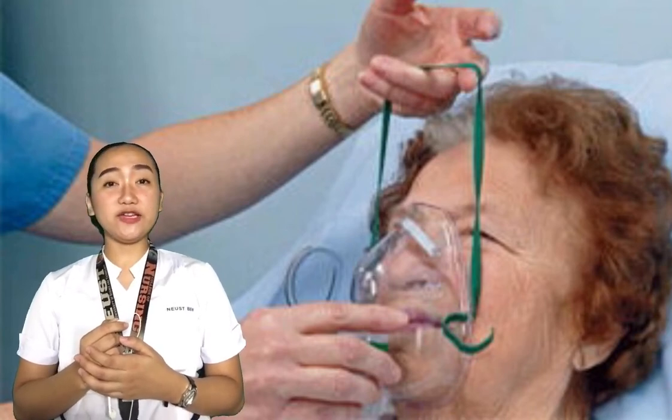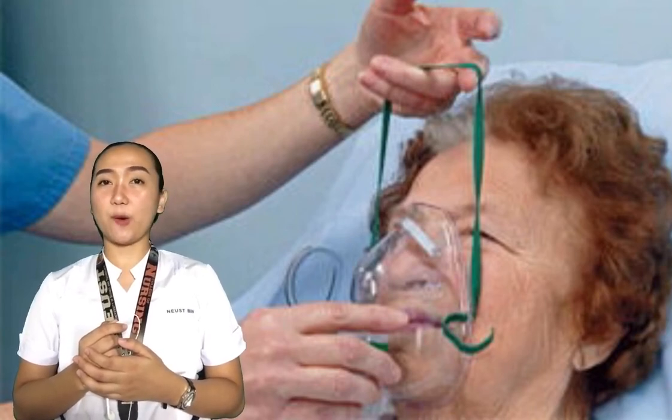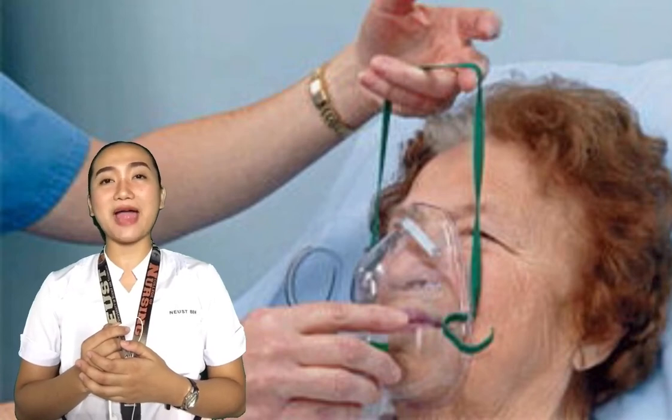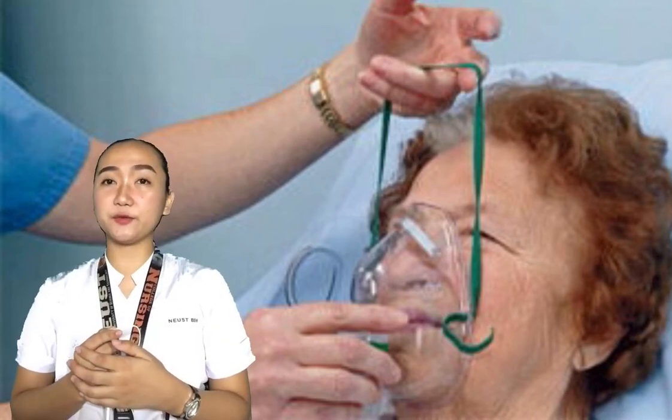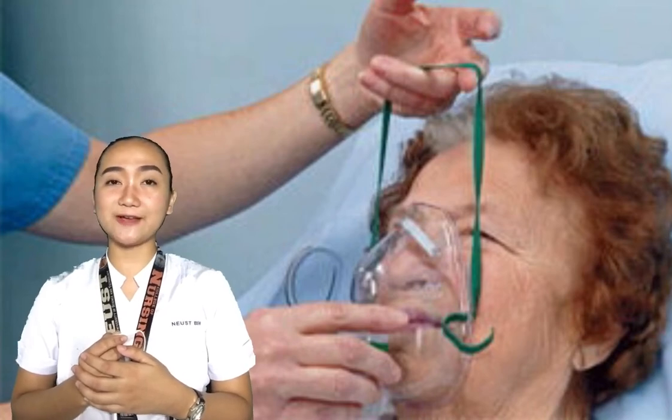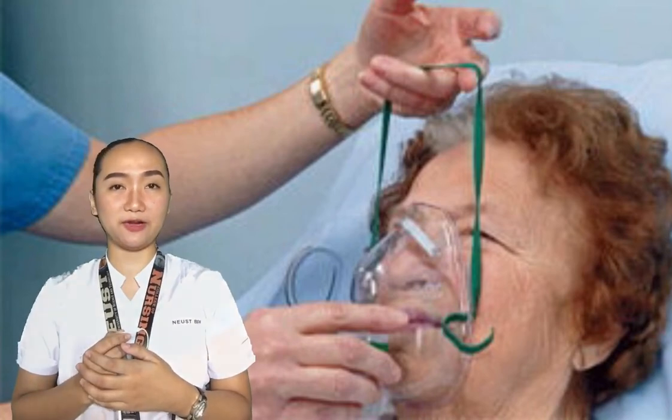Before today's video, I'm going to administer oxygen by mask. The goal for this procedure: the patient will exhibit an oxygen saturation level within an acceptable parameter.